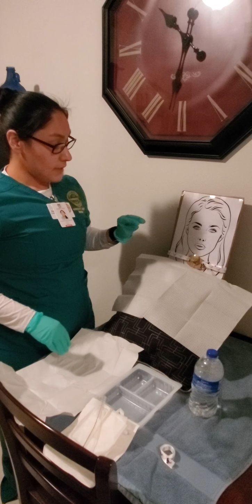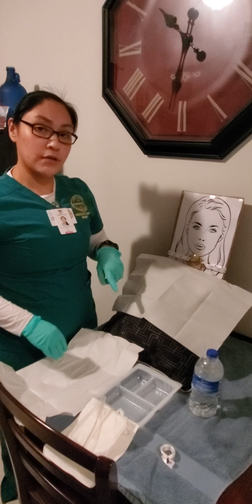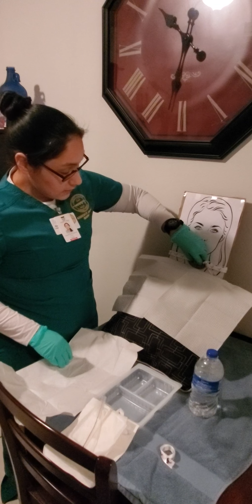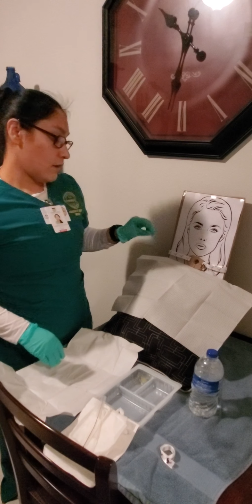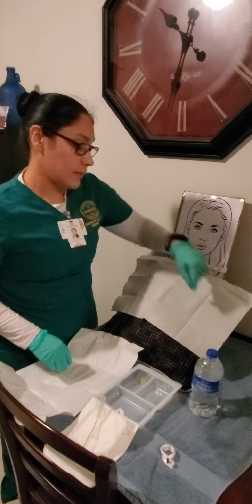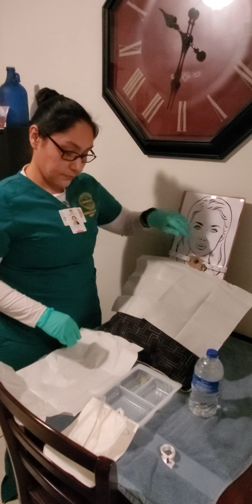With my non-dominant hand, I'm going to remove the inner cannula and place it into the first tray with the normal saline. After doing that, you want to replace the oxygen source back to the outer cannula. Okay, so we replace it.